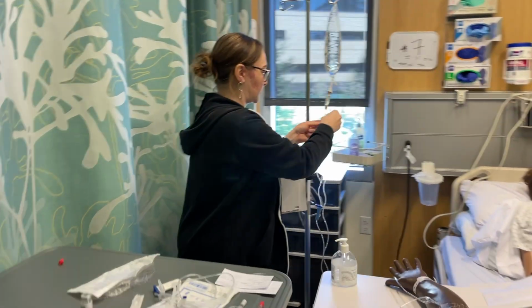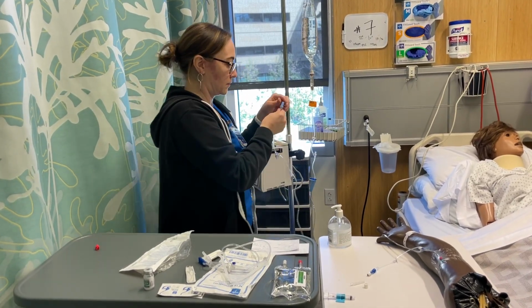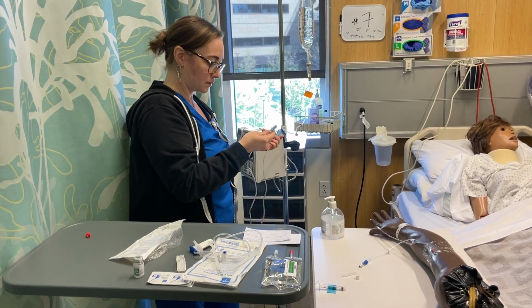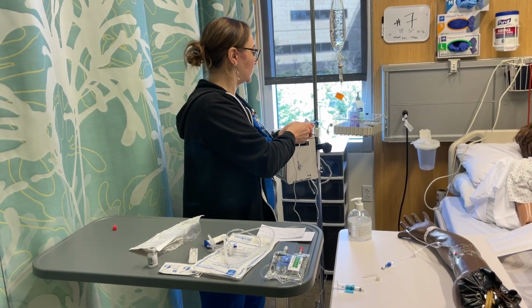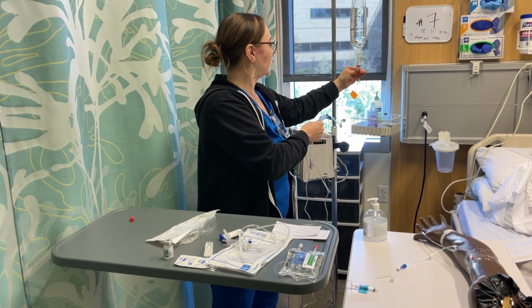And this is good for 72 to 96 hours. It needs to be changed depending on the facility. Okay. And then this is locked. And then I want to open it up. And then you have halfway.